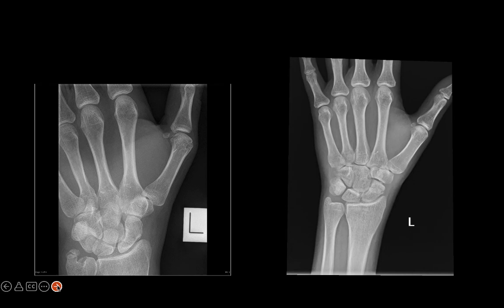And then we're always worried about the scaphoid, right? There's always a situation where the scaphoid is at risk for fracture. Remember, scaphoid fractures are the most common fractured carpal. And these are usually caused by fall on an outstretched hand. Now, the trickiness to scaphoid fractures is that they can be occult. And so there's a couple of scenarios that we think about when we heavily suspect a scaphoid fracture, but we're not sure. We should think about a PA ulnar deviation view. We should think about an MRI examination or CT to show the fracture or the edema that comes with it.